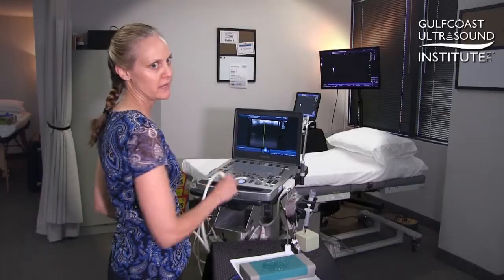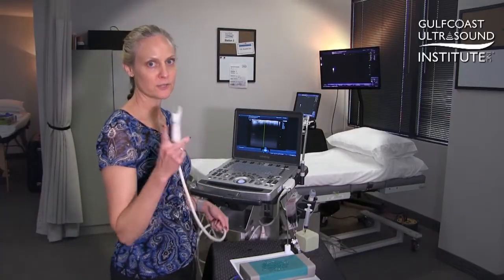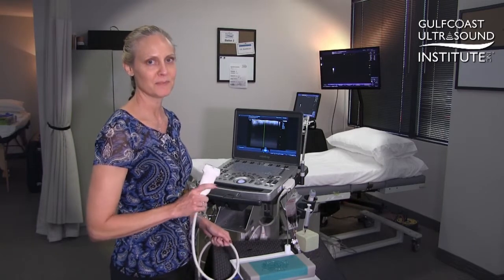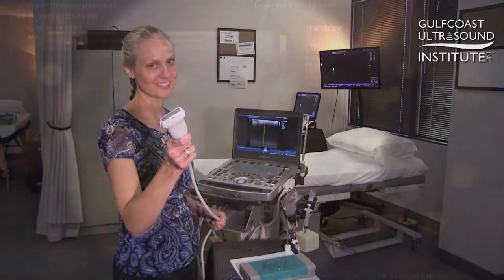By using that green M mode line and slowly turning — keeping on that green line — you'll land on your target every time. That's my hot tip. And now it's your turn to scan.